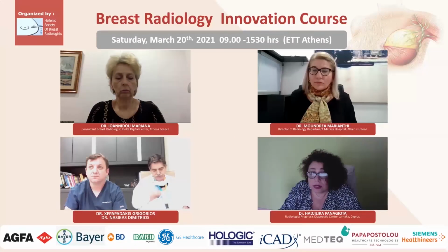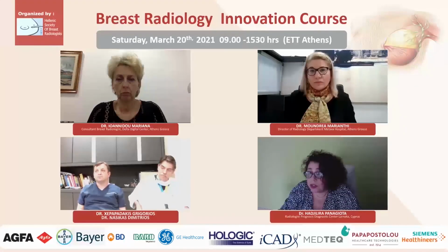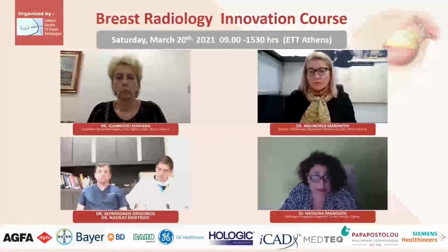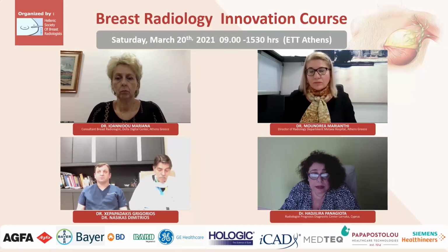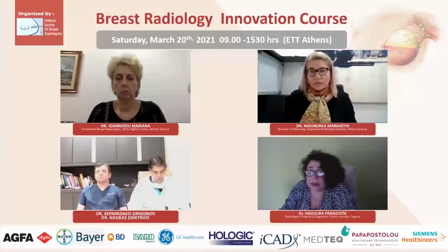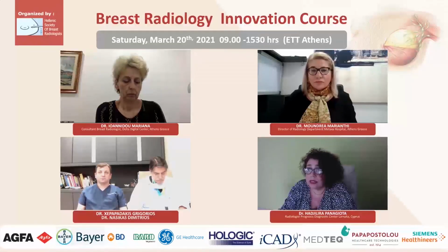The implementation of artificial intelligence in screening has the potential to address the workload issues and maximize cancer detection. It has shown potential to reduce interval cancers, and that means it visualizes some of the cancers that are missed in screening by radiologists. I think an attractive possibility is the triage of negative mammograms, that is, preselection of normal mammograms, that would potentially reduce the workload of radiologists and reduce reading time.